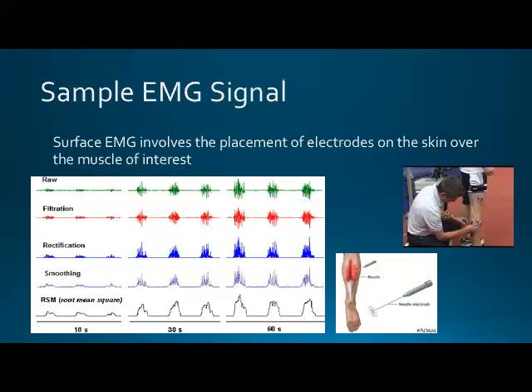One interesting thing also I want to point out before we kind of skip on is that if you look at the difference between these, so we have surface EMG and intramuscular, can anyone think of what might be different in our signal if we shifted from one to the other? So what might this be picking up if we're using surface EMG rather than the intramuscular? You can see how the measure might differ.